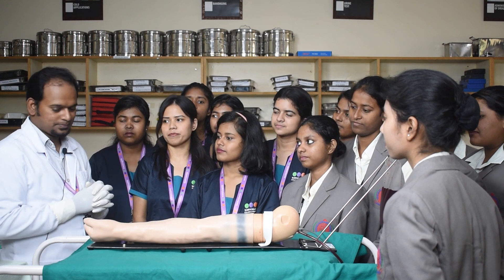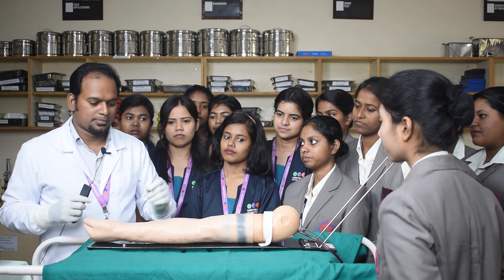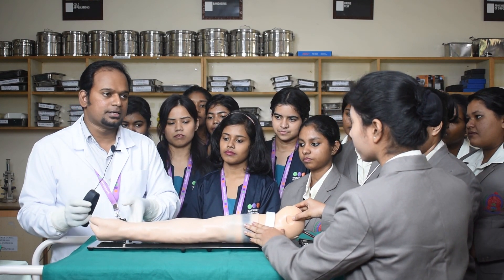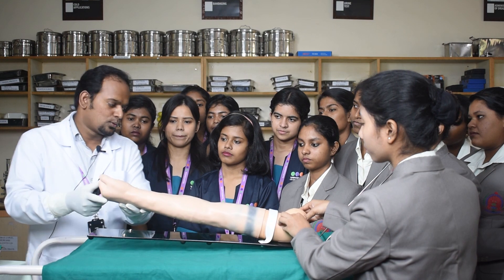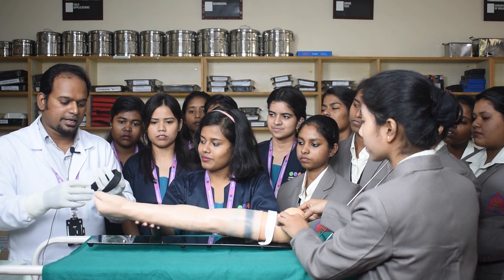Let us start the procedure. Initially, I need the help of one person to hold the hand. After doing hand washing, I have gloved myself — since this is an aseptic procedure, hand washing is important. Now, one person should come forward to hold the hand while I tie the tourniquet.